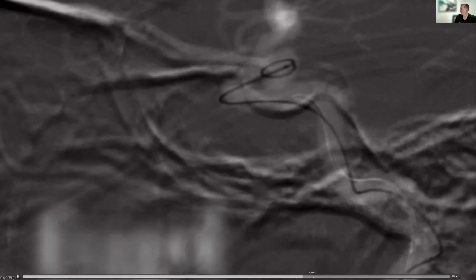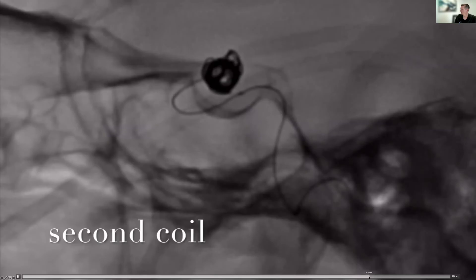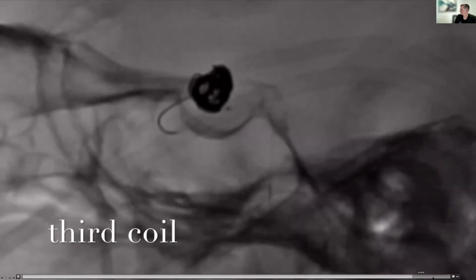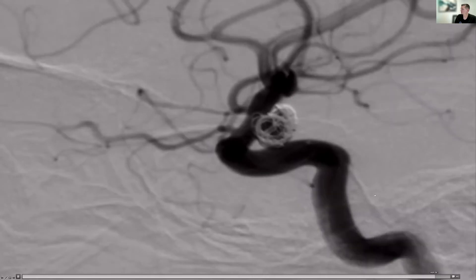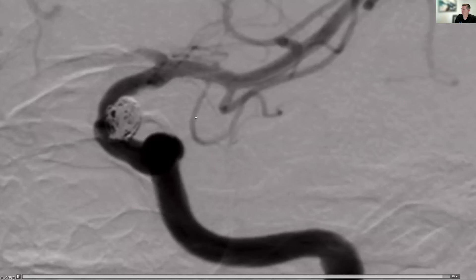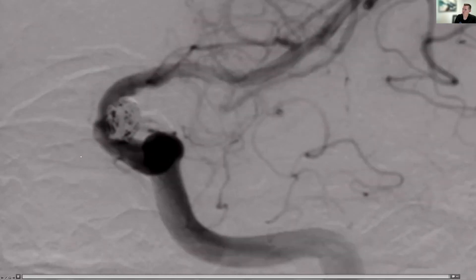Ultimately we're able to get a nice basket to form within the aneurysm and get a good coil occlusion — just a couple of coils. We've got a pretty good repair. If you need to add some additional coils later on, you can add that step later, but this is going to give a durable solution for the patient. That's the mainstay of endovascular aneurysm treatment for the past many years, since the advent of the Guglielmi coil.